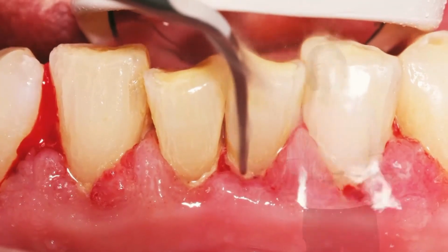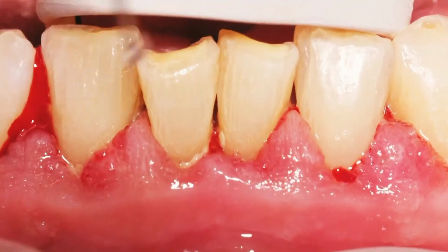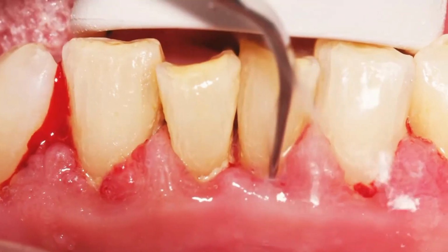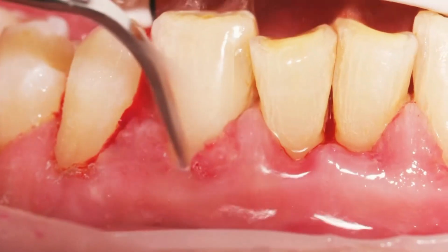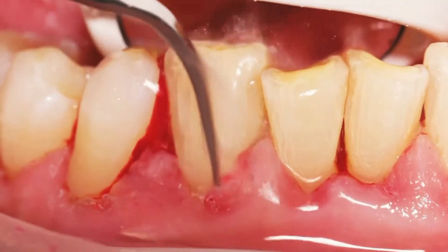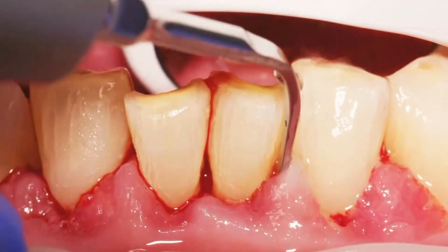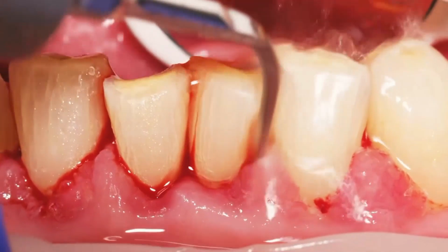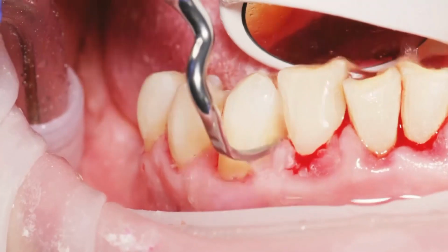So let's go to the piezo instrumentation, supra and subgingivally. Of course, supragingivally, it's easy to see if you are able to remove completely the calculus, because you can see the calculus. Of course, you need to work with your magnification, with your loops and with your light, and you need some time to dehydrate the teeth with the air syringe to see if there is any other calculus.